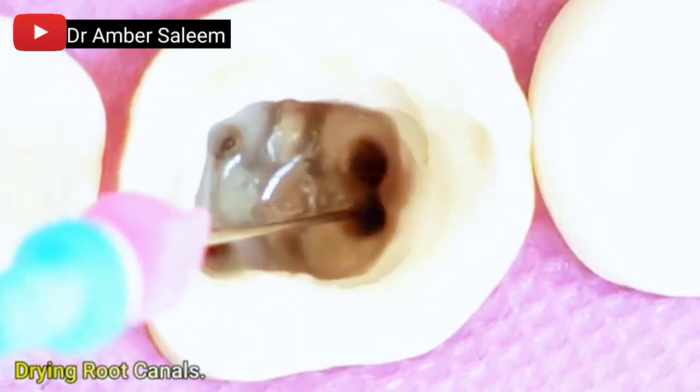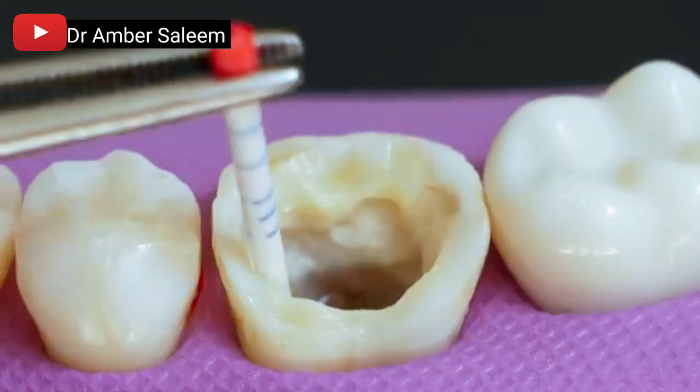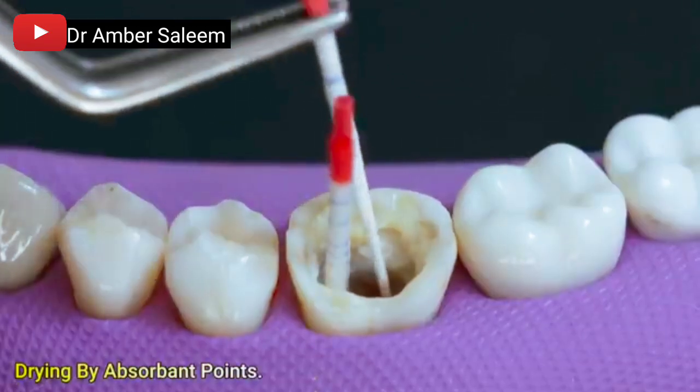Drying the root canals, first by conventional means and then using absorbent paper points to ensure the canals are fully dry before obturation.